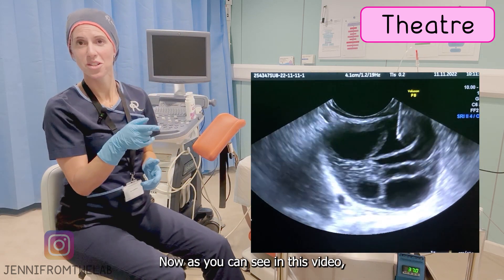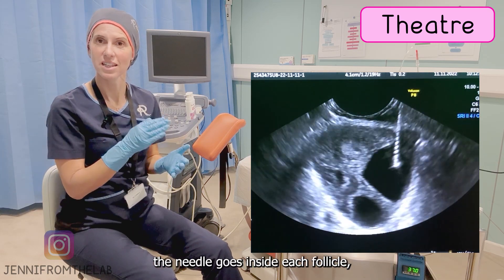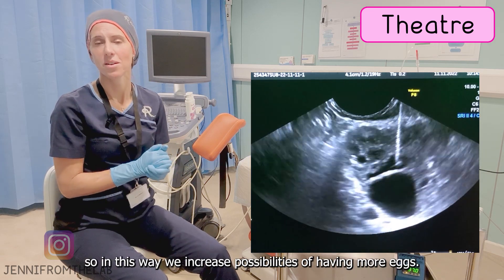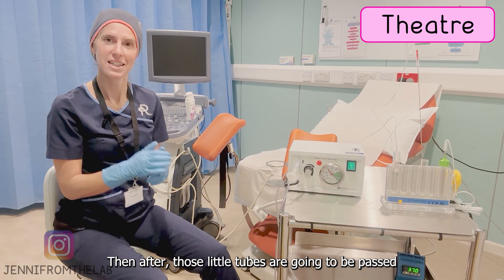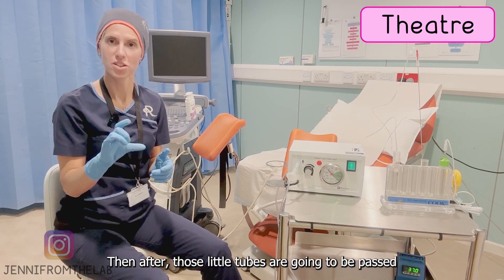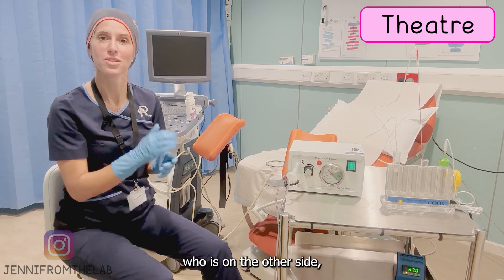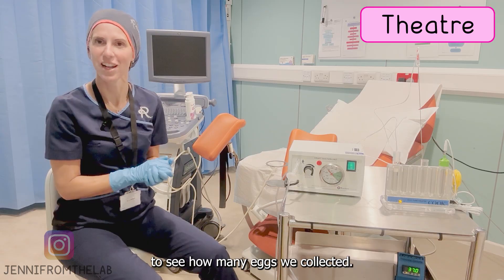As you can see in this video, this is a real egg collection. The needle goes inside each of the follicles and we make sure we aspirate everything we see, so we increase the possibilities of collecting more eggs. After that, those little tubes are passed through the hatch to the embryologist on the other side, and they analyze all the fluid to see how many eggs we have collected.